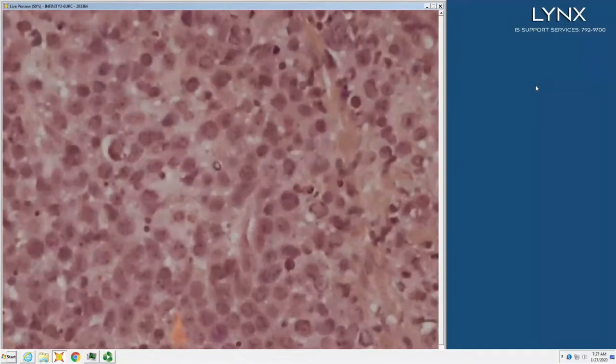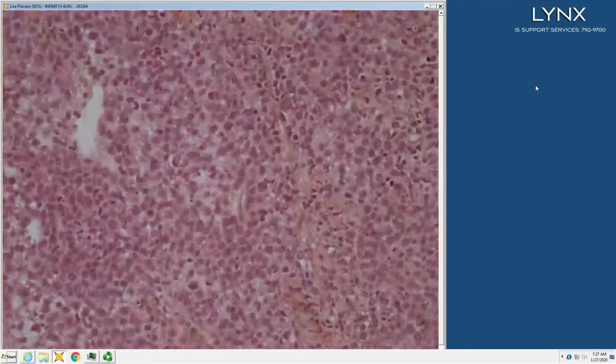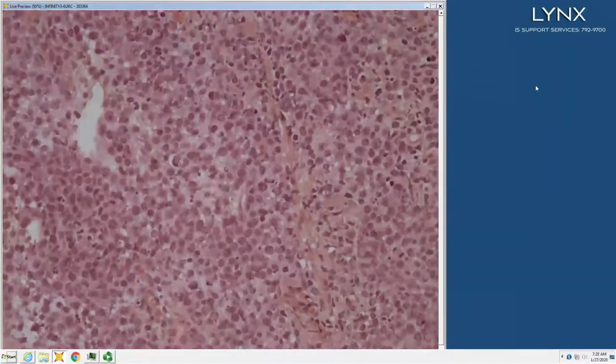And you look also for things like BCL2, which, when it's expressed in a follicle center population, protects against programmed cell death. So BCL2 expression you're supposed to see in marginal zone cells.